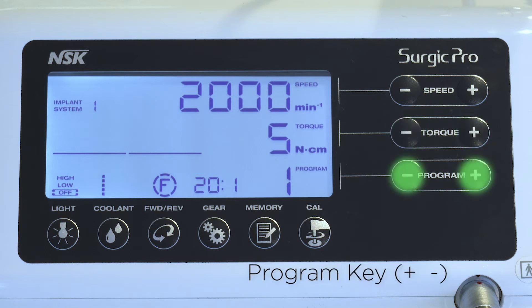Select a program number by pressing the program plus or minus key until the desired program number is displayed. Press the light key to select the light level, either off, low or high. Press the coolant key to select the coolant solution flow.